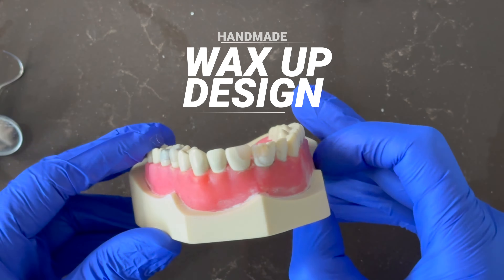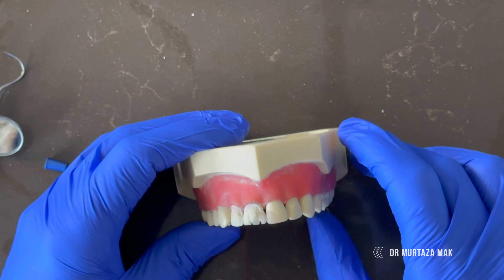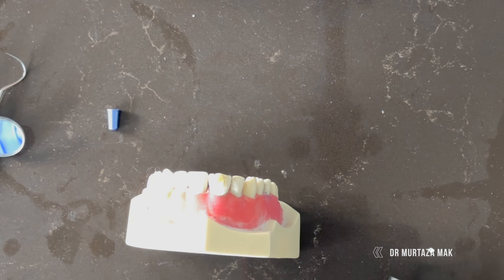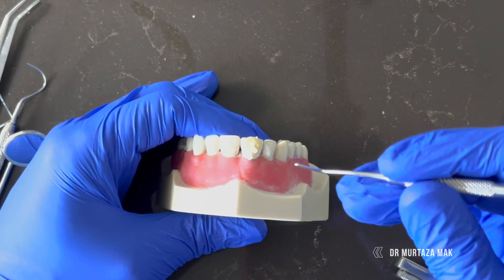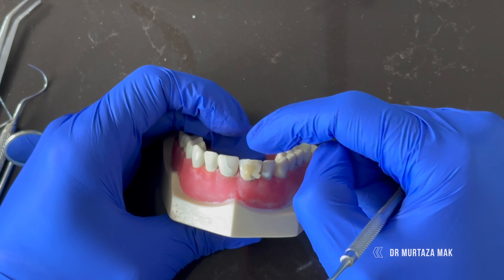So this is the initial teeth condition. The front tooth is a bit bigger in size, a bit bulky, a bit damaged as well. If you see the proportions are a bit wrong — one is a bit wider, the other is a bit more slanted. So first thing we do is correct the proportions. I'm going to build one tooth at a time using packable paste composite. If I'm doing it inside the patient's mouth as a direct mock-up, I'm going to check along with the face and the lip profile how everything fits — not just in the mouth but looking at the whole face.